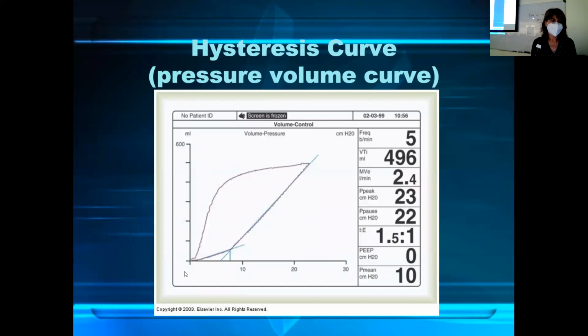So on the x-axis is pressure. On the y-axis is volume. So as the air goes in, pressure is building up. There's a certain point here where lots of volume starts to go in.